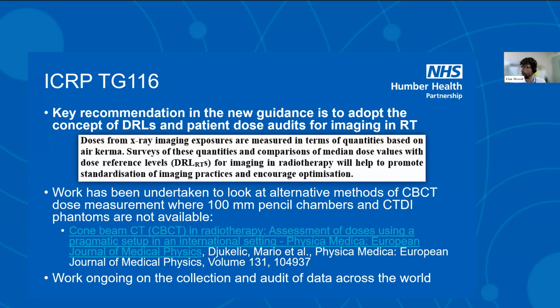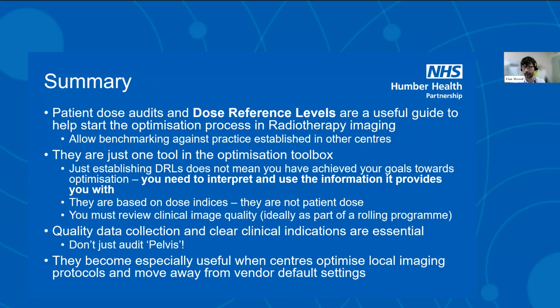There's also been some work undertaken through the Mentee group around validating an alternative technique for defining that CTDI, because one of the things we are aware of on an international audience is the availability of the relevant kit, the 100mm chamber, the CTDI phantom. So there's a paper that's just been published that looks at alternative methods using Farmer chambers, stacks of solid water, perspex, things like that. Okay. So please have a look at that if you're interested. And work is ongoing to try and do some sort of audit in a similar vein to what we've done in the UK, looking at typical doses.